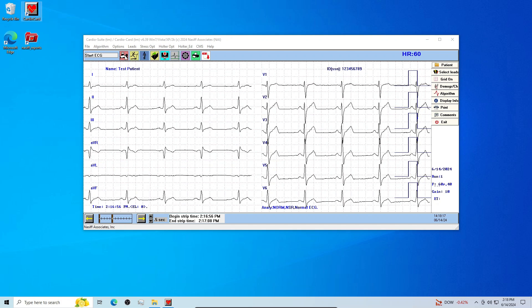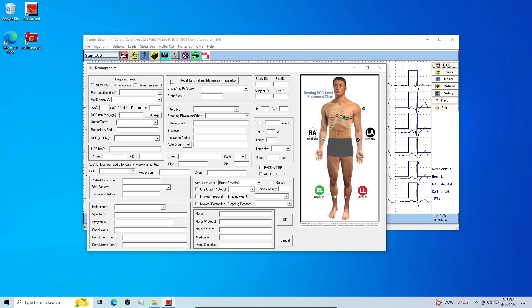Once your patient is connected to the system, click Start ECG at the top left or center right. Fill in at least the first four patient demographic fields, or click Recall Last Patient to auto-fill their information. Then just click OK.